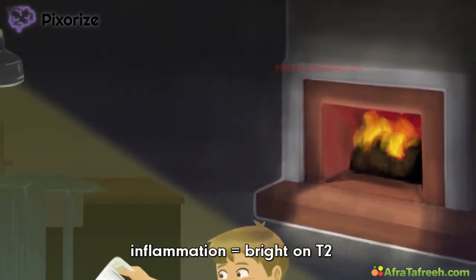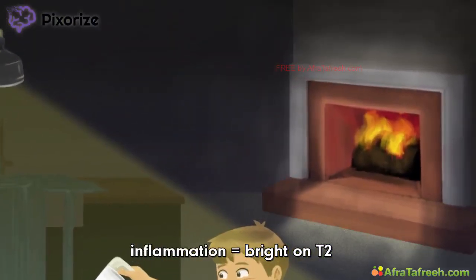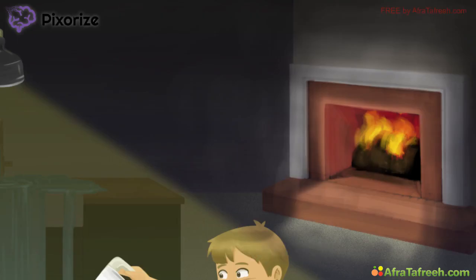Check out the fireplace at the back of the room. Notice that it's giving off its own light, creating a pleasant glow for everyone involved. Again, the fire here should help you remember inflammation, but this time the fire is so big that it's giving off its own light. This should help you remember that inflammation is bright on T2 imaging.